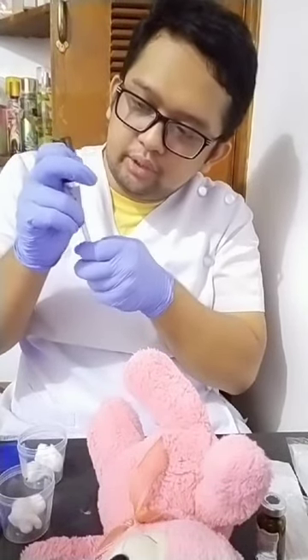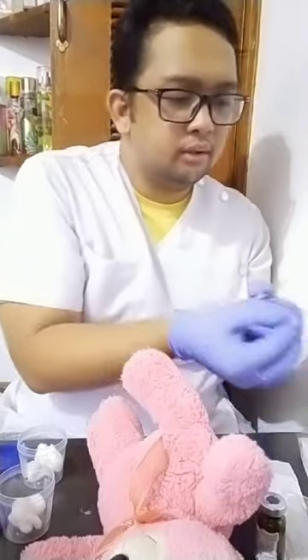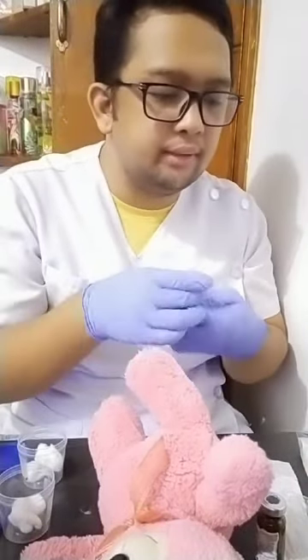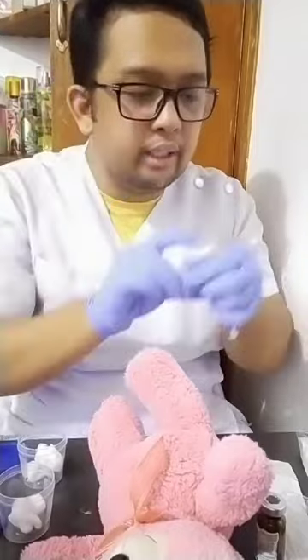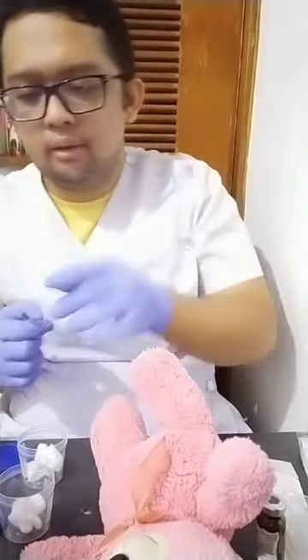You have to consider to know the proper dosage. The proper site and the proper route of administration is IM. So the proper site for the pediatric 1-year-old is the vastus lateralis for IM. Use a separate new needle for it not to be blunt. And then disinfect the site, inner to outer circular motion.